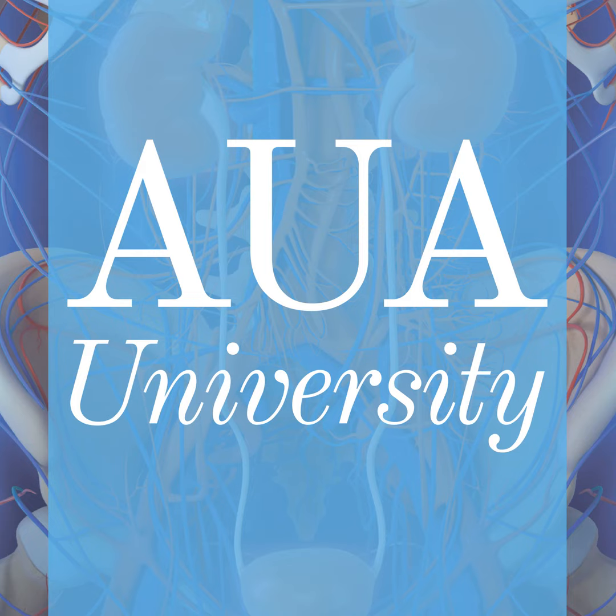When you have a patient who is scheduled for a PSMA PET CT scan, there are only very few things you should remember, or at least advise your patient. He needs good hydration, because the gallium PSMA is excreted by the kidneys. He does not need to be fasting, but good hydration is necessary to give good PSMA PET CT scan results. As you can see, there is a renal excretion of the gallium PSMA, and this has some advantages but also some disadvantages.